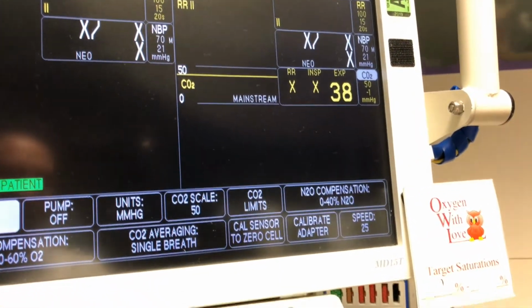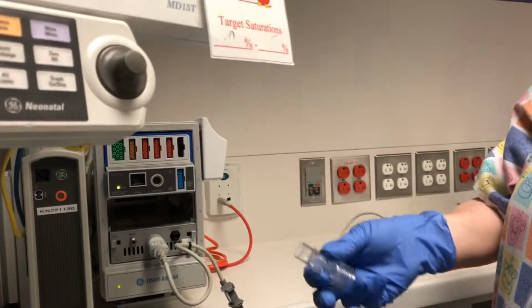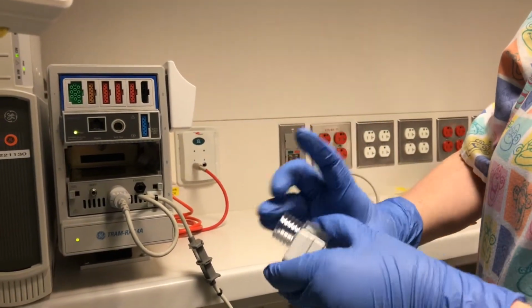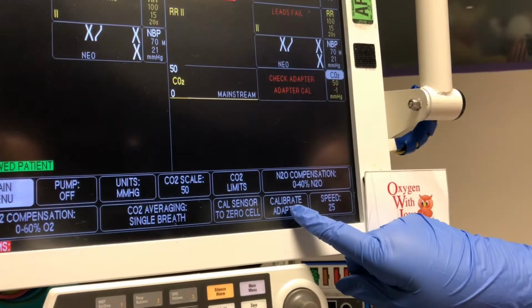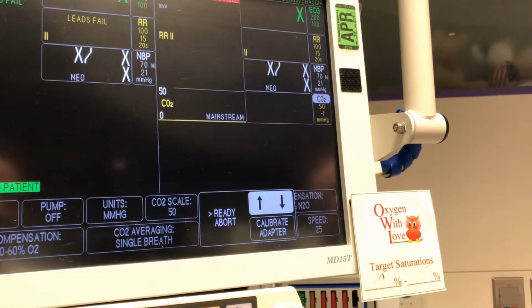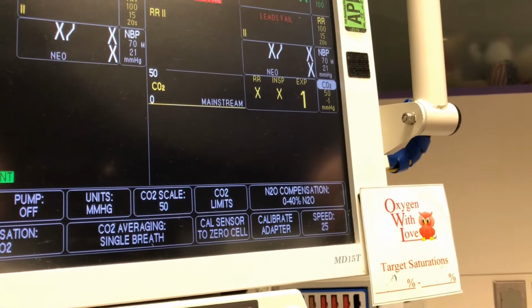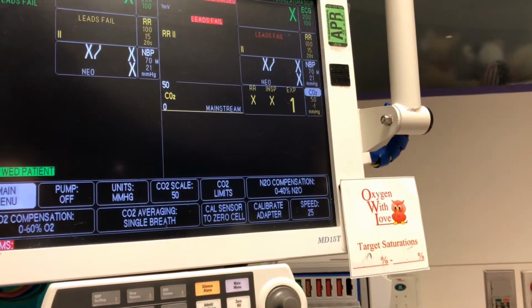The last step you have to do is to calibrate the sensor that's gonna go in line with the patient. So you just slide it in. Okay, and then once you do that, you wanna press the button that says Calibrate Adapter. You press that twice, and then you'll see it calibrating up here at the top. Okay, so those are the 3 steps you have to do before you start it on a patient.